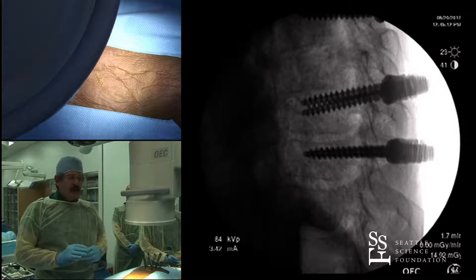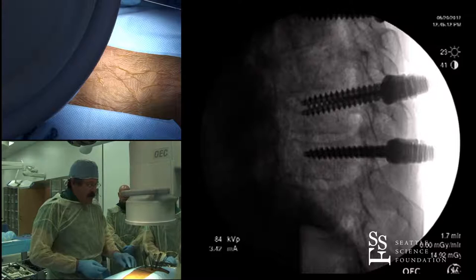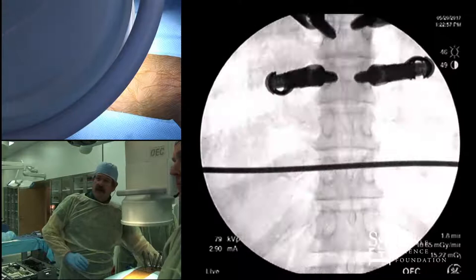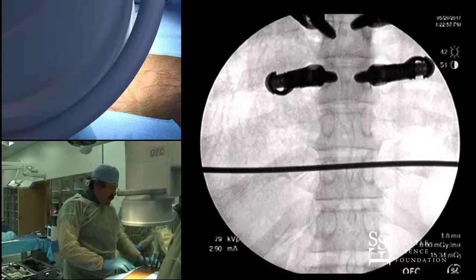I've already put six of the screws in, so I'm going to show the workflow for putting screws in — we'll put the last screw in with this workflow. I have one that's a little medial that I want to show you. Typically I'll lay a metallic object and get an AP image. You can see the screws above, and I'll adjust down. I'll get a true AP using tilt to line up the end plates, which we've already done.